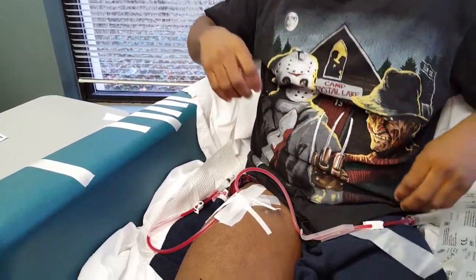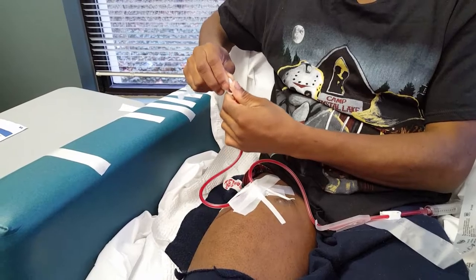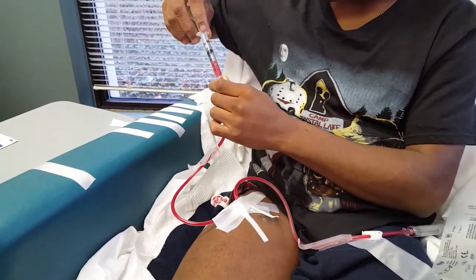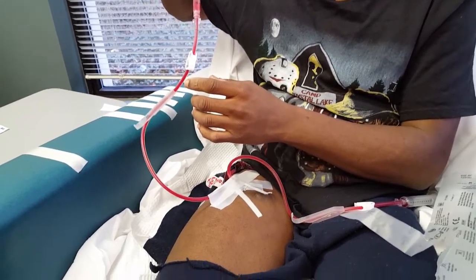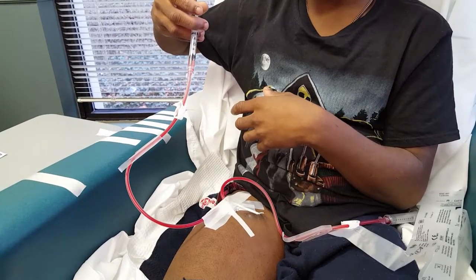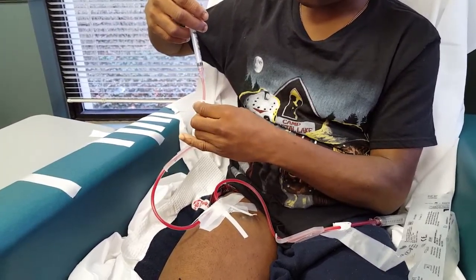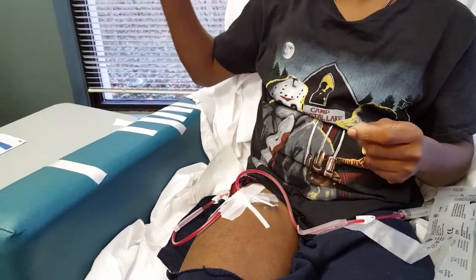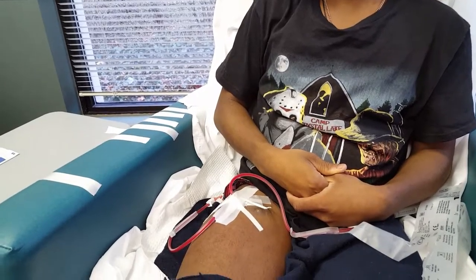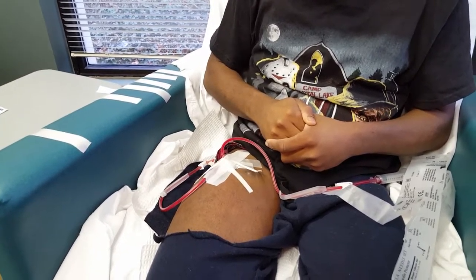Now, what do you do? Give heparin. Then I give the heparin: pull back a little bit, make sure it draws back, and then push it in slowly. I push it in slowly because it burns. Clamp it. And then she's getting the red line for the arterial. What's the red line for? That's to pull. That sounds painful.